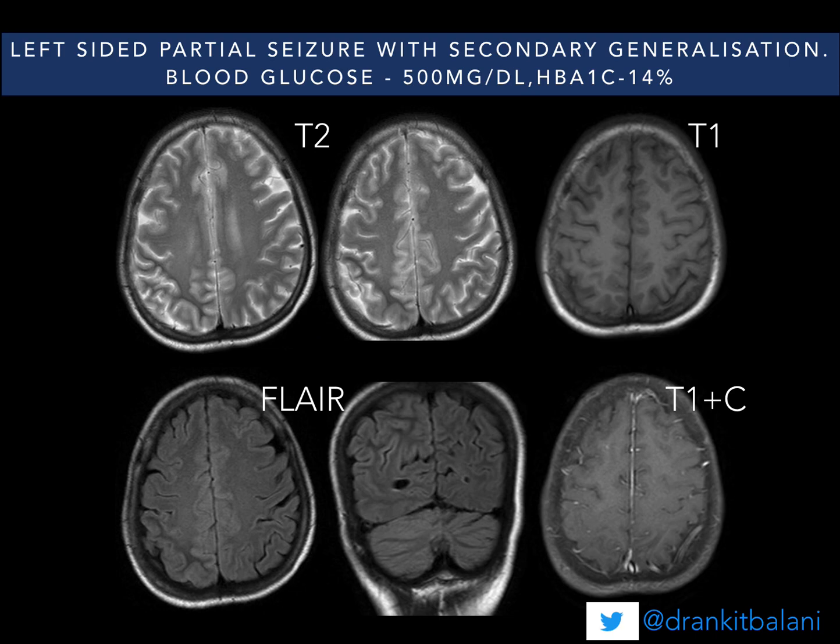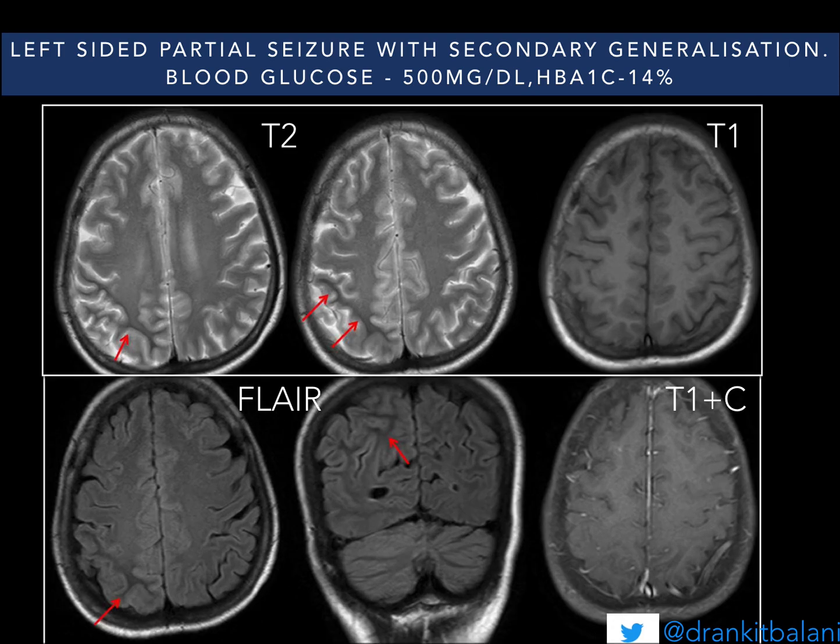Try to locate the abnormality initially. Look at the symmetry; it always gives you a diagnosis and always helps you localize where the abnormality is. So let us see what are the findings.